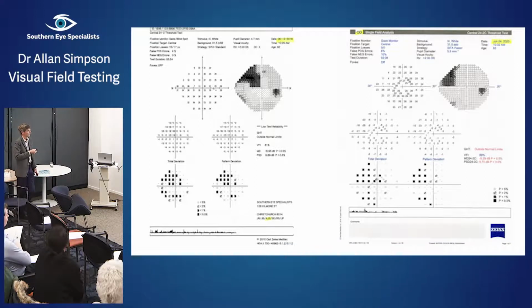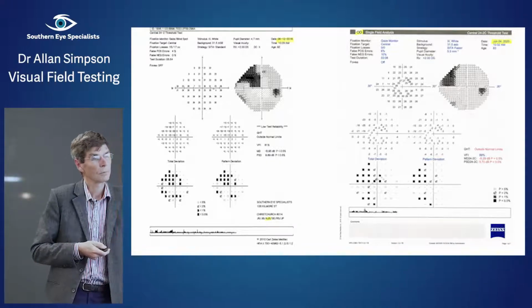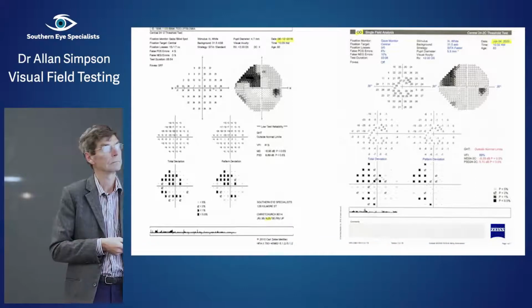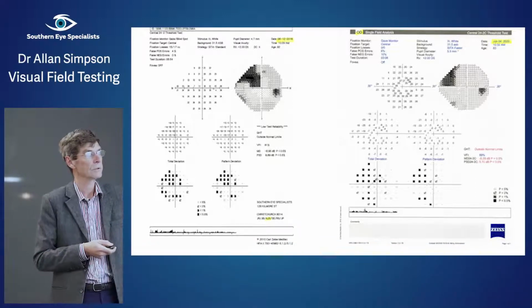This is just a little bit less dense and a little bit less picked up on the recent test than the previous one. Must be the next ones that are all same day. Yeah, sorry, that was one more of the older series. But from now on, they're all same day, same patient, different test.